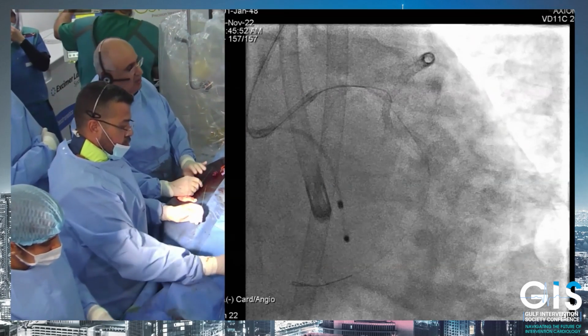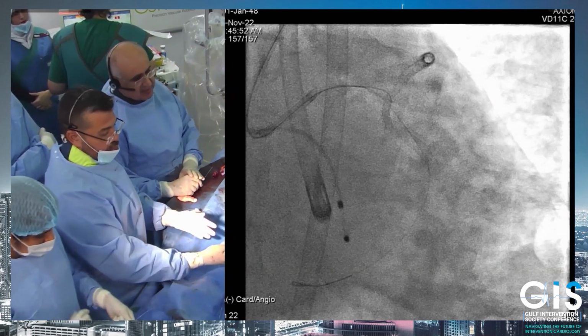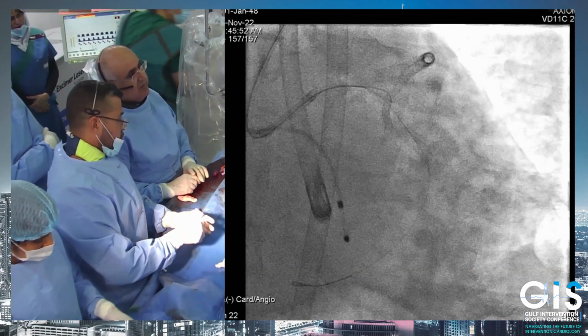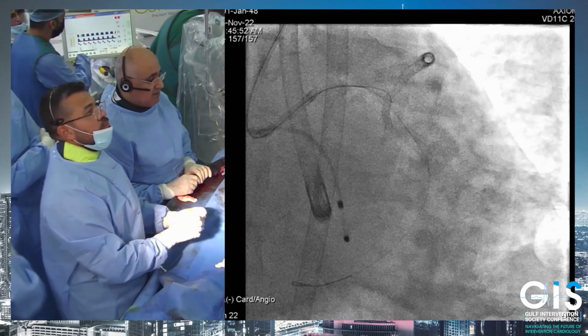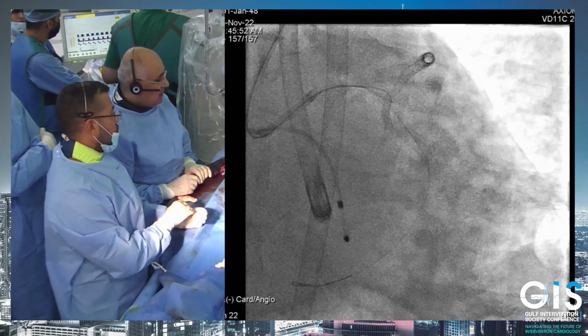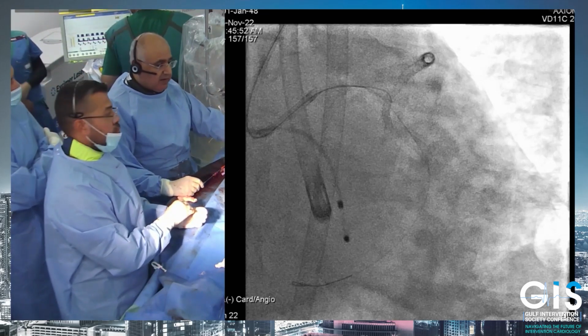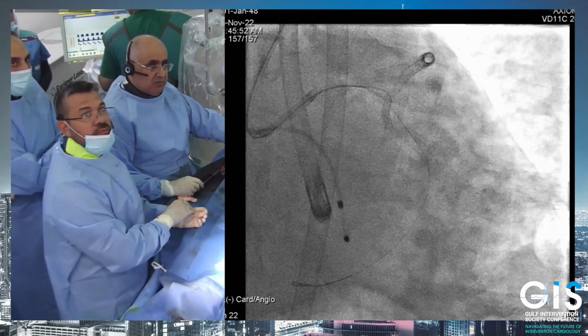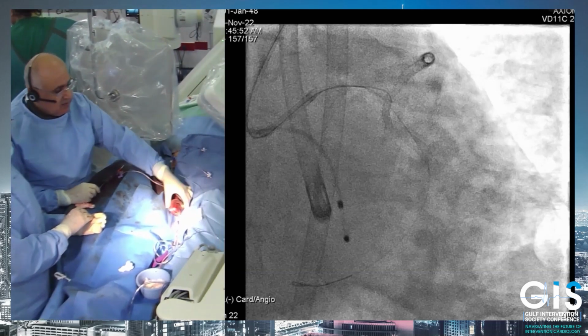And what we thought, we will do him under a left ventricular support device, because this is a case where you predict kind of bad scenarios. So we were lucky to have IVAC 2L here in place in the right femoral. I don't know if you can see. Can you move the camera to my hand, please? So this is the IVAC pulse cath.